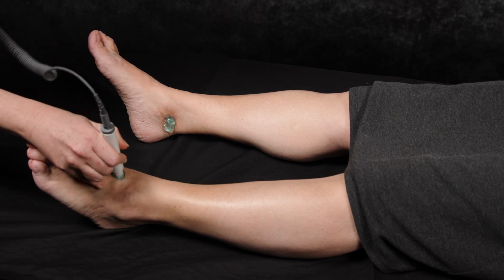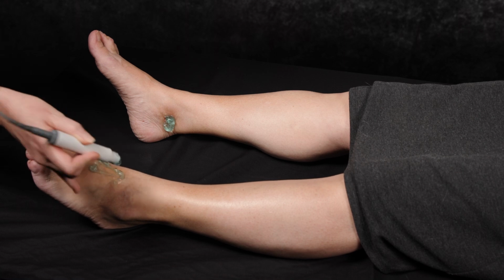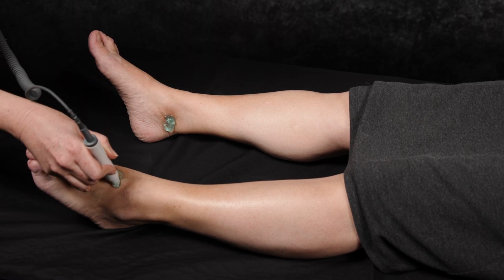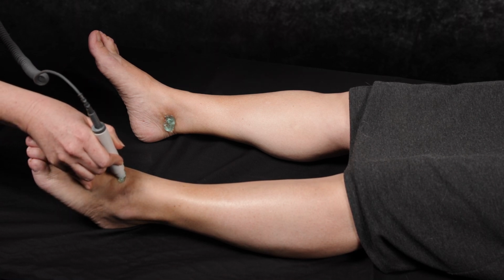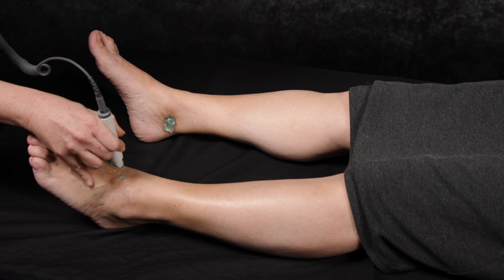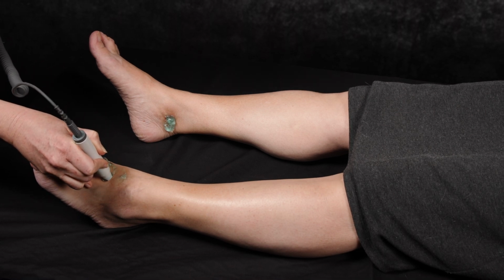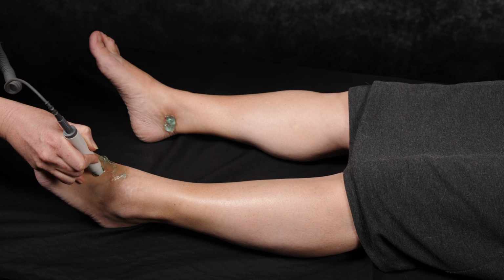You might decide to start higher up if you're having trouble, and you anchor your hand to the foot and draw an S shape. Adriana's got lovely pulses which are easy to find, but you just draw across, up and down and over, and eventually you'll run into the pulse.